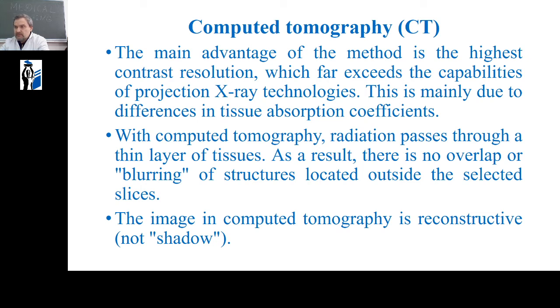Once again, we emphasize the features of computed tomography. The main advantage of the method is the highest contrast resolution, which far exceeds the capabilities of projection X-ray technologies.